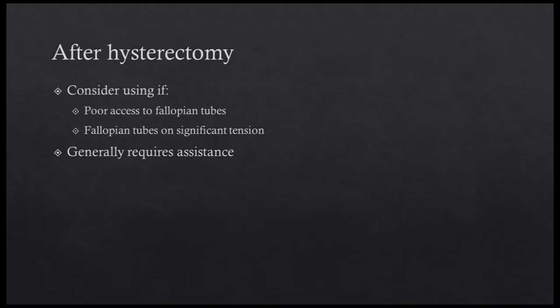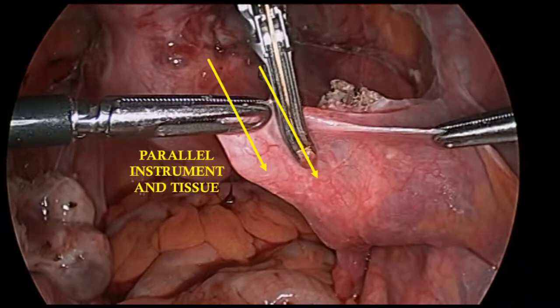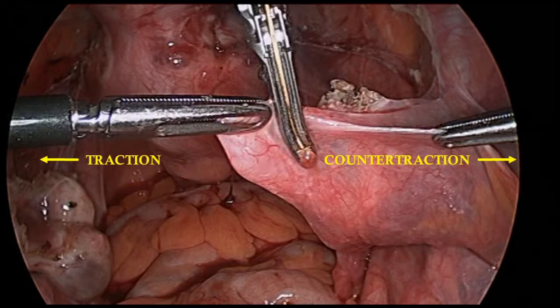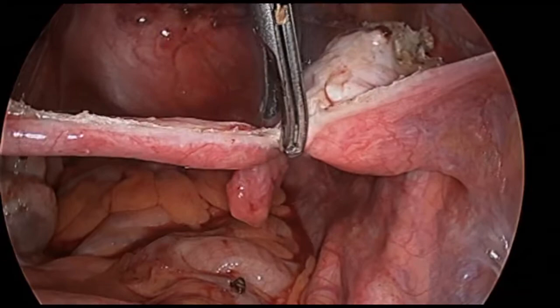Performing the salpingectomy after controlling the uterine blood supply may be necessary if there is poor access to the fallopian tubes by obstructing pathology. Additionally, an enlarged uterus can place the fallopian tubes on significant tension, making manipulation difficult. This technique almost always requires an assistant to optimize tissue presentation as the fallopian tube is no longer held up by its attachments to the uterine cornua. The assistant also provides gentle counter-traction to optimize the dissection. Dissection may begin either at the cornual or the fimbriated end; in this case, we begin at the cornual end.